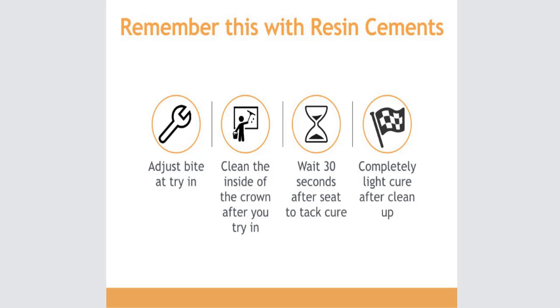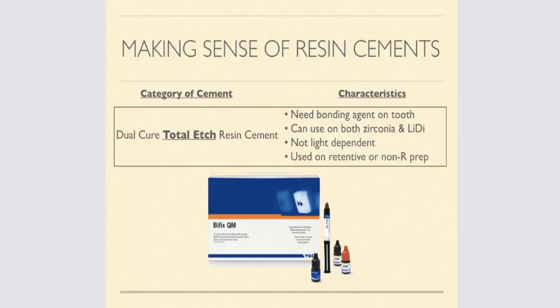And then I completely light cure after the cleanup so that I can help initiate light to help shine through the zirconia or lithium disilicate. Enough energy will penetrate that restoration if I use a 20-second cure on the buccal and a 20-second cure on the lingual. So that's really important that we remember this with the resin cements.